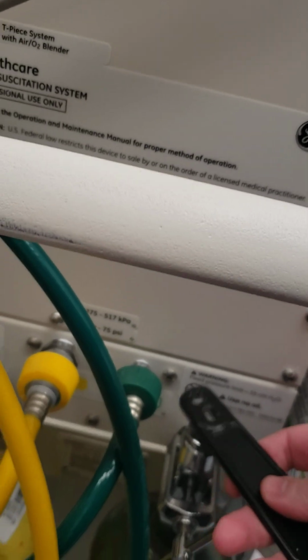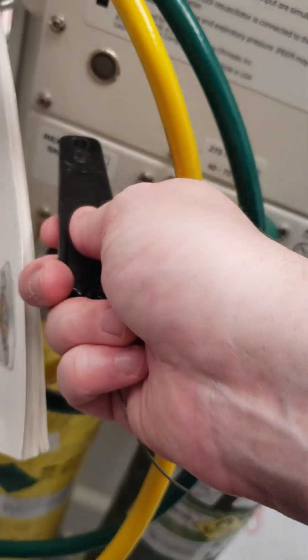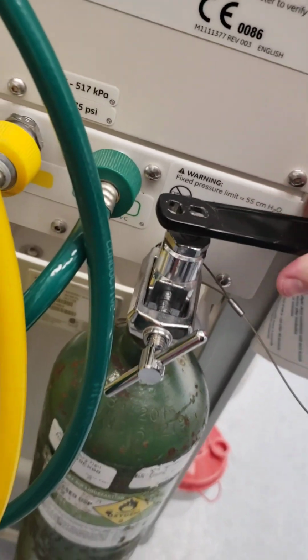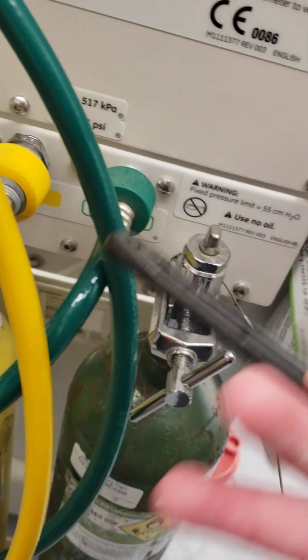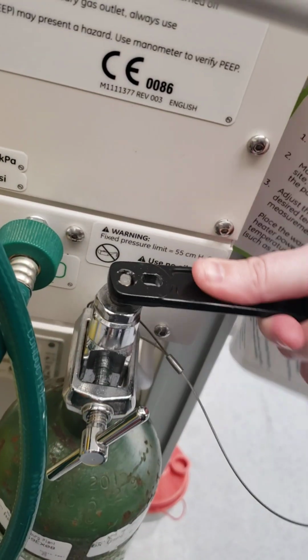Okay, this little black thing here is your key for your tanks. You do need this to be able to open your oxygen tank and your medical air tank. So you're just going to twist it until it's open. Right now it's closed, and we're going to go around this way. You want to make sure it's all the way open. You're going to hear your machine make lots of noises while you do it. That's okay. Just means you're doing what you're supposed to do.